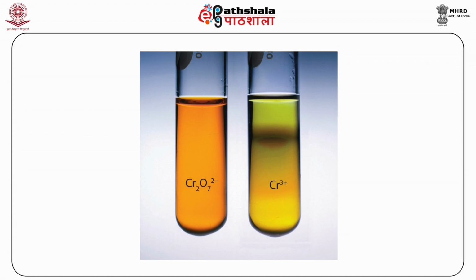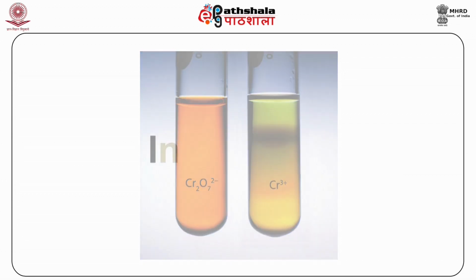Potassium dichromate is an orange colored compound which absorbs visible light in the wavelength region of 420 nanometers. As the reaction progresses, the concentration of potassium dichromate starts decreasing, which in turn affects its absorbance. The breathalyzer thus indirectly determines the BAC by measuring the amount of light that is absorbed by potassium dichromate prior to and after its reaction with alcohol.